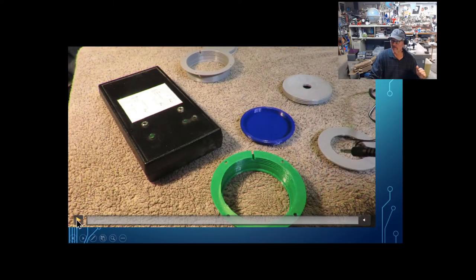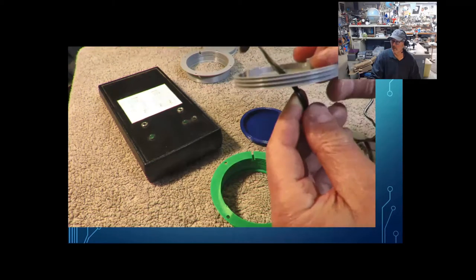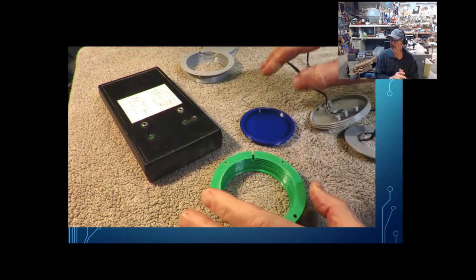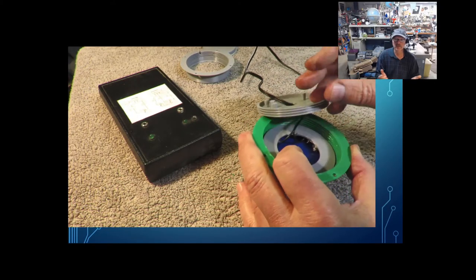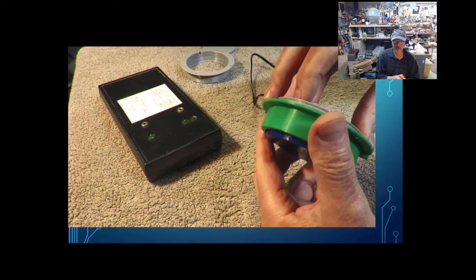Once that's done, really you just have to assemble it here. There are no modifications necessary. These are right off the printer without doing anything. I've designed it so it's pretty easy to put together. Drop the cap in there. There's the ring you've just made. Drop that in there and thread it together.